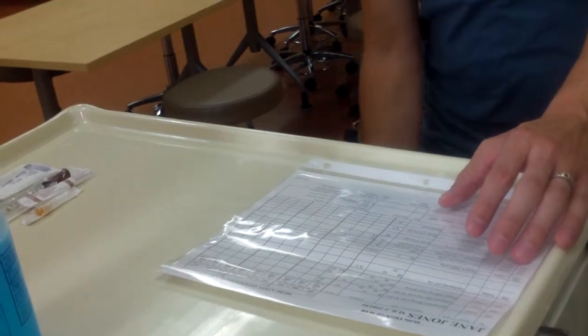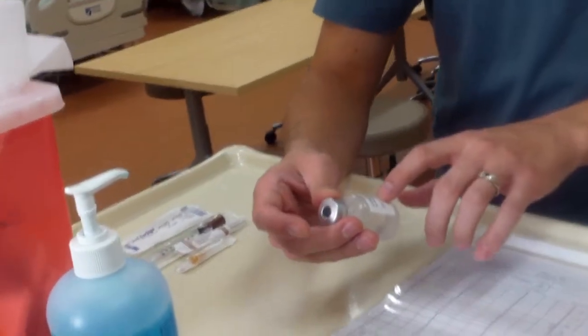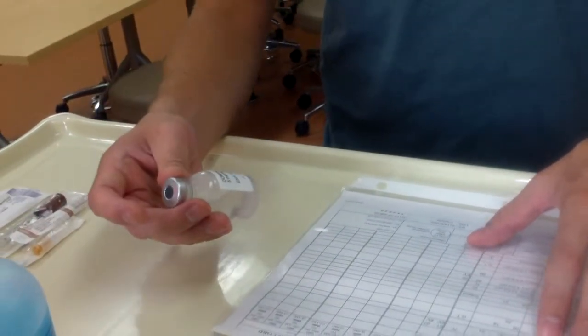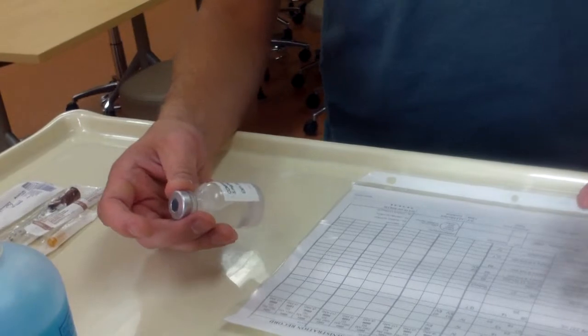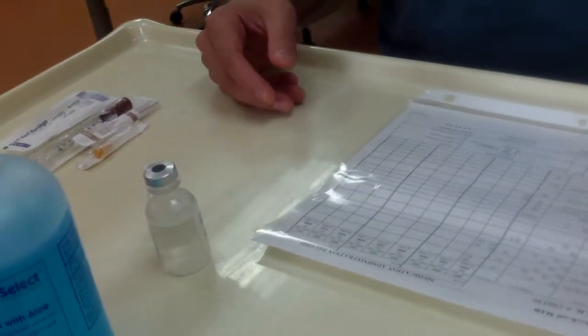That's my first check. So I need to know that I have a vial. I've checked the expiration date. That's good. And I'm also doing the 5 rights. So I have the right time, route, dose, and medication. So that works out. The next medication I'm going down the list is this one. It's by an ampule. So I have drug X from an ampule, and that is the right medication. So I have withdrawn my medication.